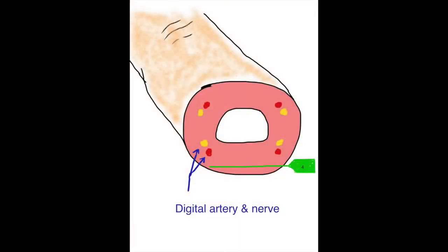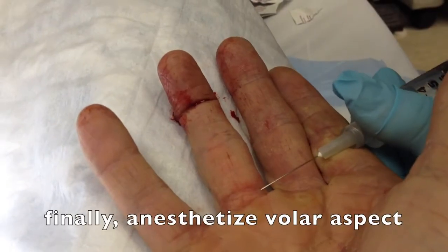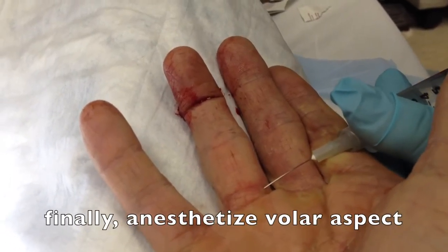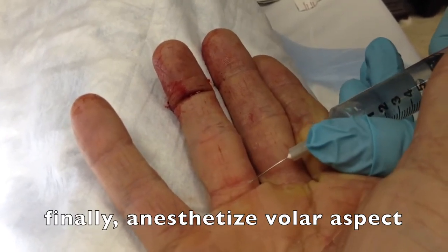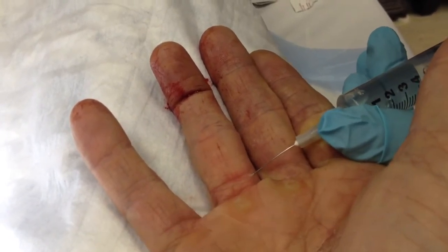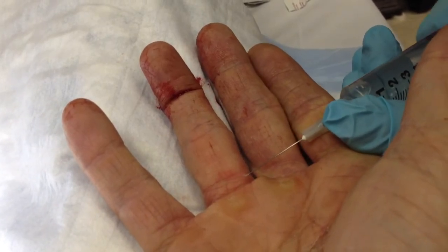Perform the final injection on the volar aspect of the hand. Now, this is typically the most painful area of injection for the patient, which is why we save it for last, when that part of the finger has already, in theory, been partially anesthetized. We'll go across the finger, advancing without injecting, and then as we inject, we pull the syringe back.